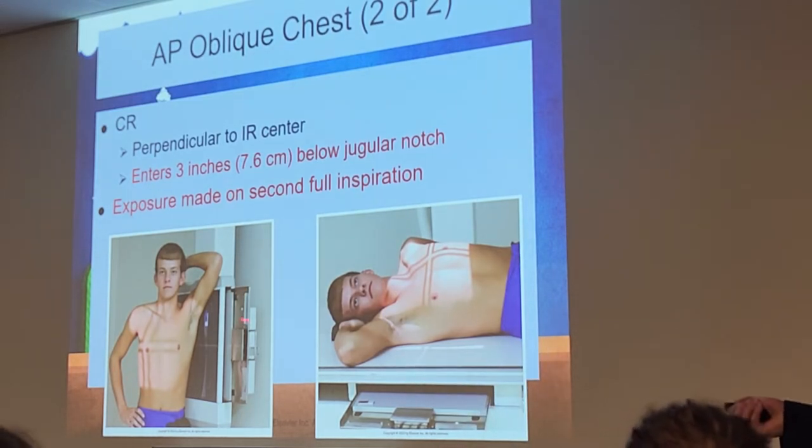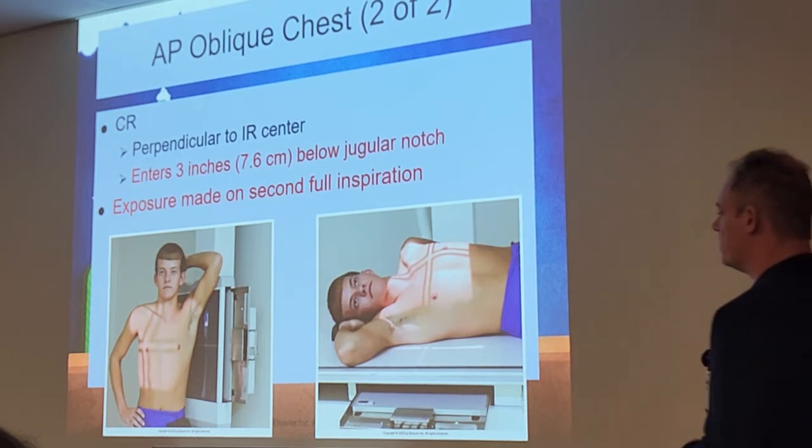LPO, because his left side is down. And look, remember, with obliques, we always center, once again, towards that upside, no matter what oblique we're doing. You're always going to center towards the up or elevated side.